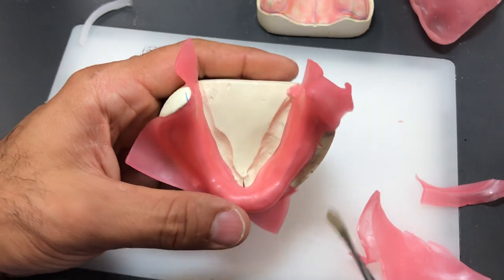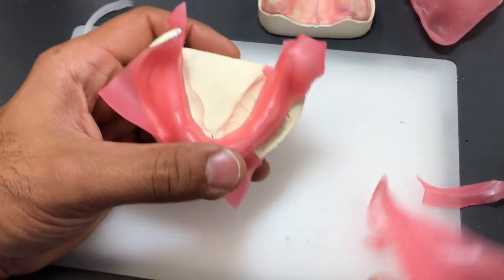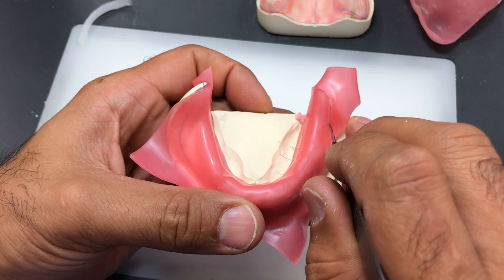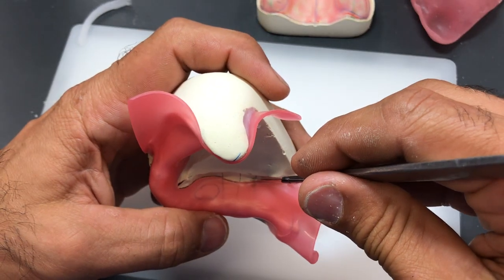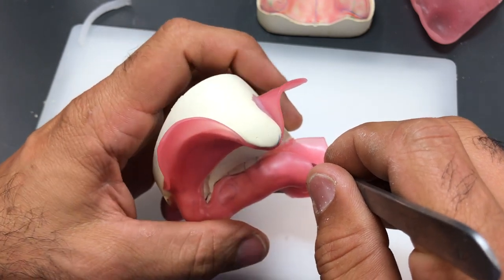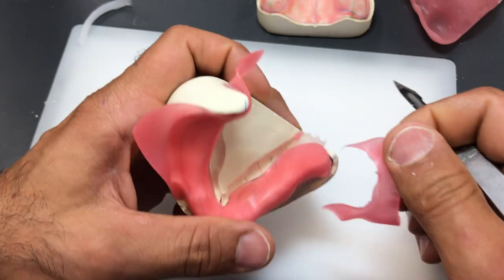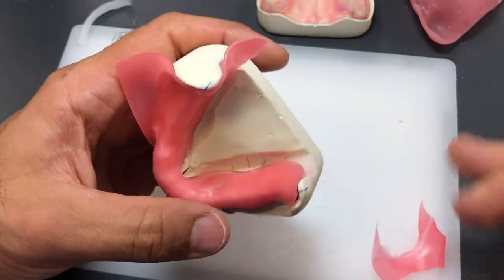If the wax lifts, just go back and readapt it with an instrument. And again, as I'm working through my blade, it's basically held in the same position, and it's my left hand that does all the work here, really. I'm rotating the model to accommodate the blade position.